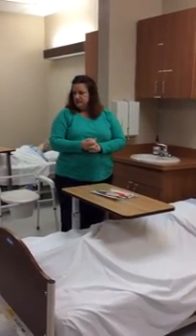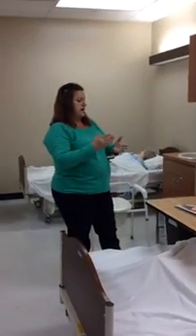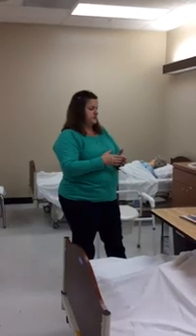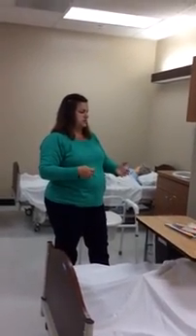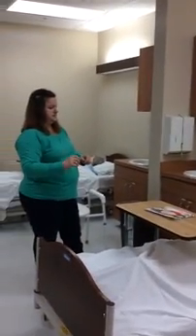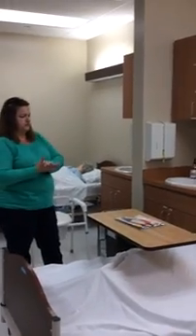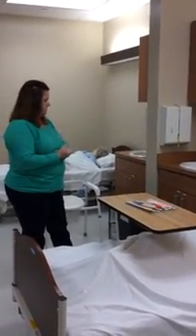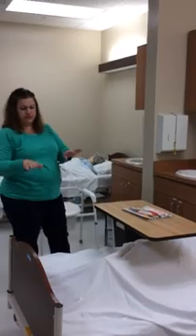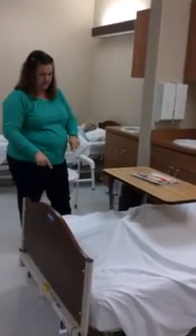Okay. All right, so any corrections that I might need to make is I gave her a preference on whether she'd like to roll on her side or lift up her hips when I placed the pad underneath her. I closed the curtain before I started my skill and I opened it when I was done doing patient care. I offered her a paper towel. She got to test the temperature of the water before I started doing care. I did not raise the level of the bed, so I don't have to worry about lowering it. I checked the tubing for kinks, and I'm done.